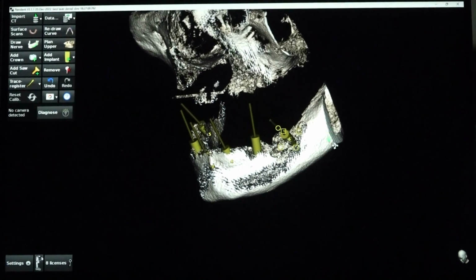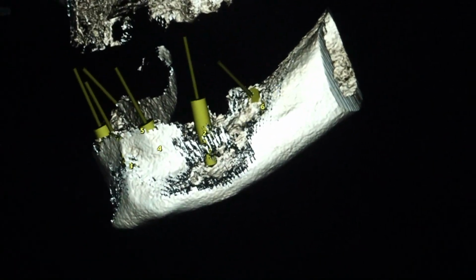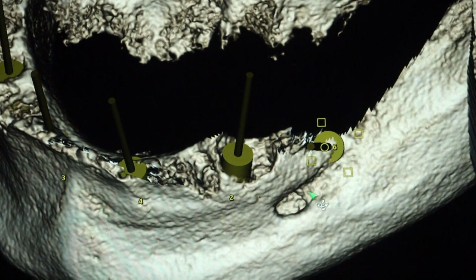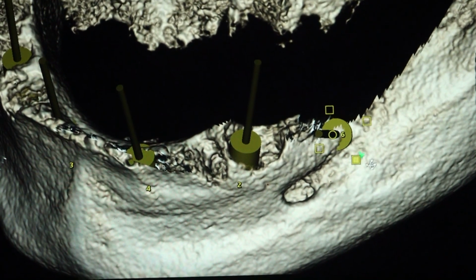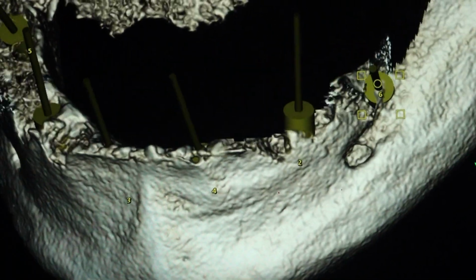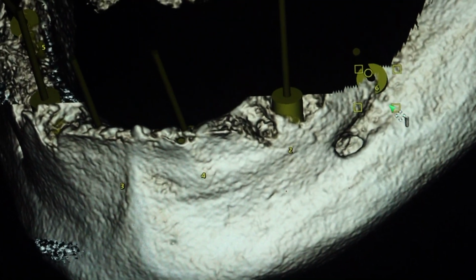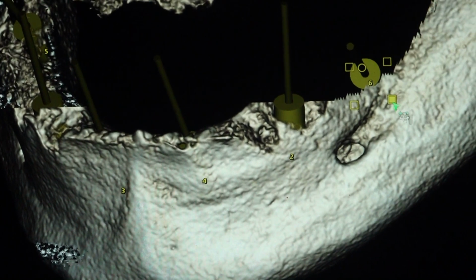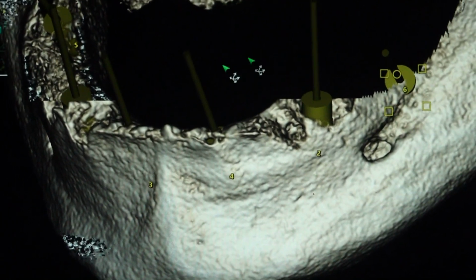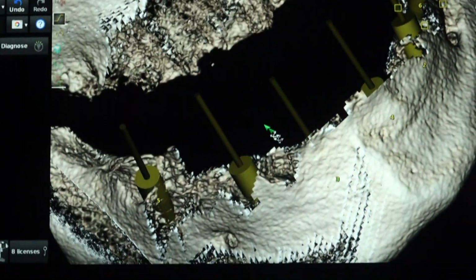See, what I am telling is, you can see here. See here, no? The nerve is exiting and creating a channel and exiting till here. Better we open the flap nicely here and do the drilling. If we do flapless here, we will be drilling through this depression, poking the nerve and injuring it. Okay. So that is why flapless is not always good. So nothing wrong in opening the flap.